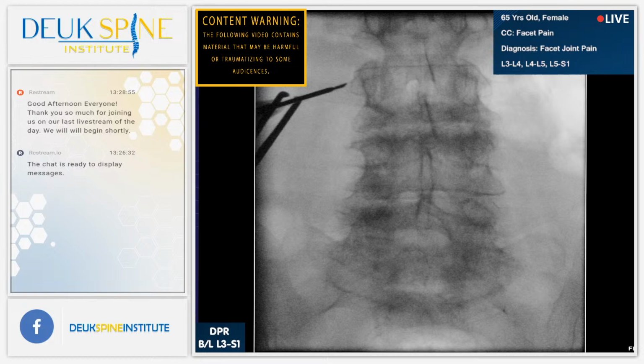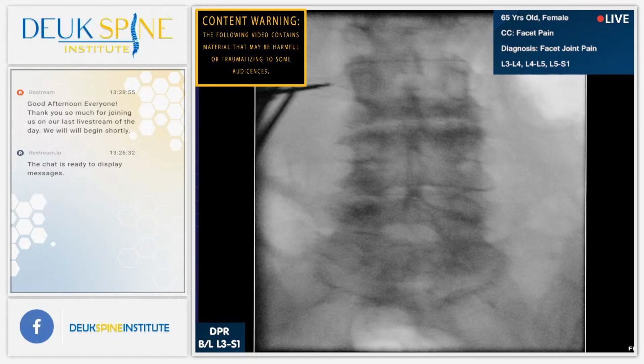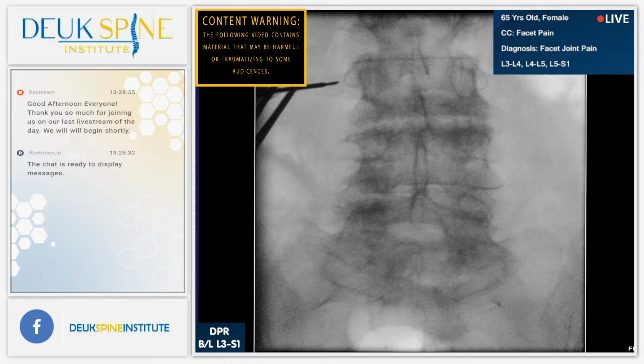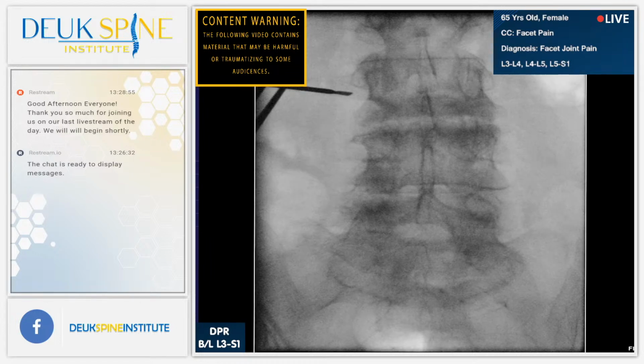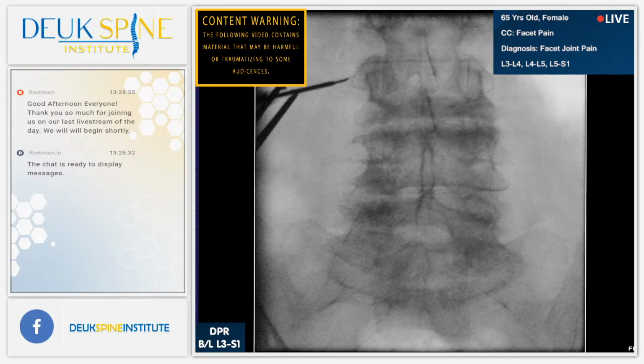Because we're not under general anesthesia. I don't know if it's reflex or if it's conscious. That's a great question. Let's try a little bit deeper and see if it helps. So I'm pretty much where I need to be. Let's try. Feels a little bit too low. I'm feeling the wall of the facet. I think that's as perfect as it gets.